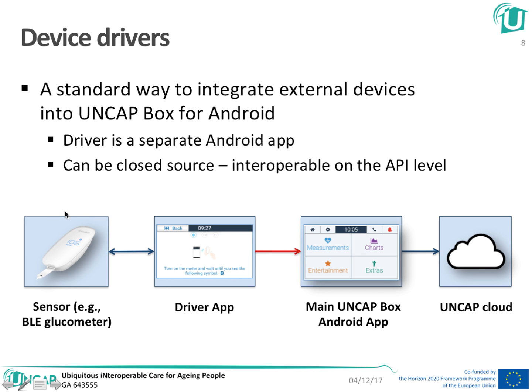In this picture here, you see a glucometer, and this glucometer is paired with a driver which understands it, and both can be provided by the same company. Now, in this case, of course, we've developed the driver, and the driver speaks here on the right side, the red arrow, the standard UNCAP API, which means it can communicate the data to the main Android application, and that one can in turn pass it to the UNCAP cloud.